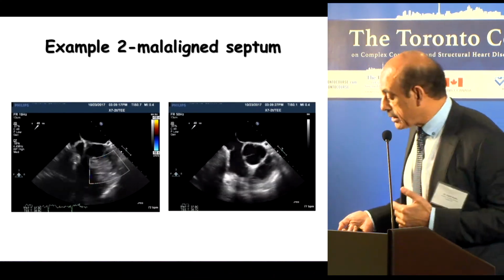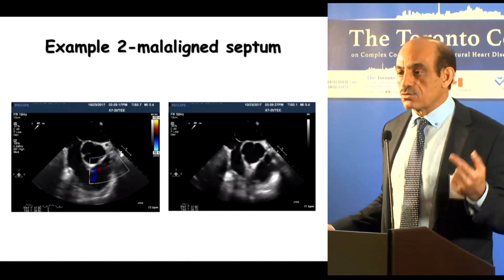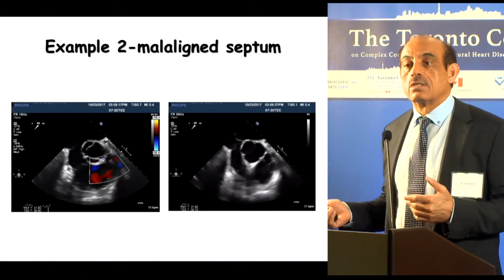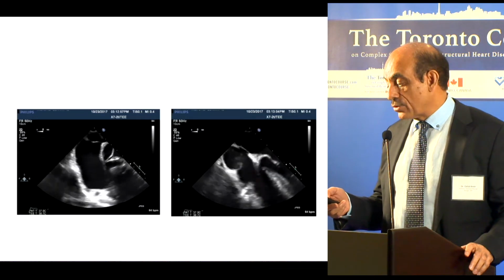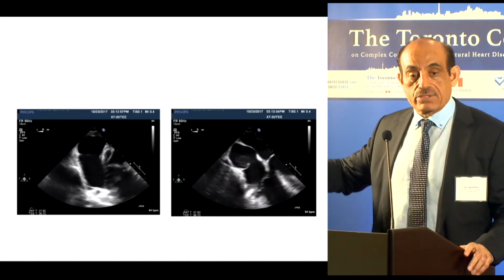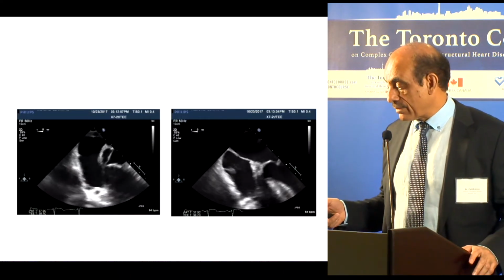This is a septum that is tilted. It goes this way, doesn't come this way, and you don't see any nub, or what you call the aortic mound, in this. Now, as subtle as this finding is, it is really, really important. We always say, oh, we don't understand this, we don't understand erosion, we don't understand the septum. So we're going to argue about this for a long time. As again, here you see, if you see the whole non-coronary cusp, the aortic rim is way on the left side of the non-coronary cusp area. So this is, in our definition, a mildly malaligned atrial septum.